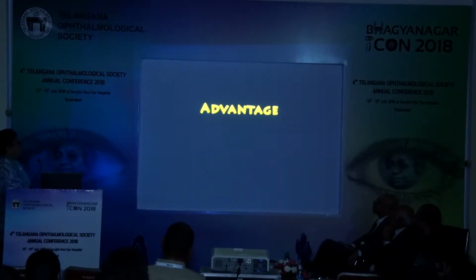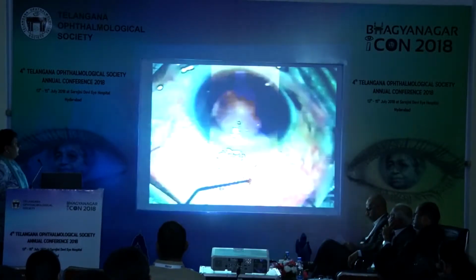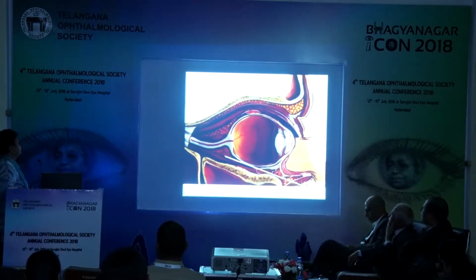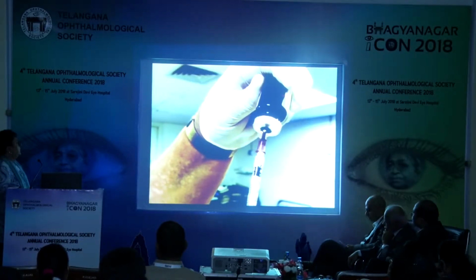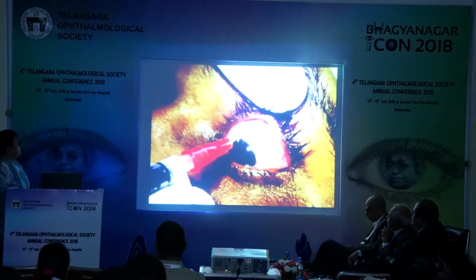Relative advantages of the procedure are: topical anesthesia avoids pressure on the optic nerve from the volume of peribulbar injection, so it is safe in advanced glaucoma. Injected mitomycin C helps to deliver fixed dose of the drug in a repeatable fashion.